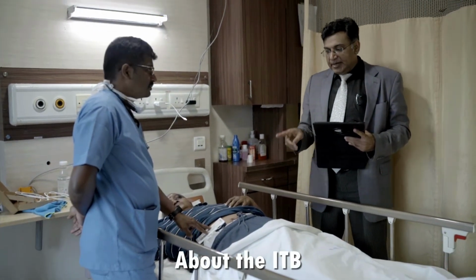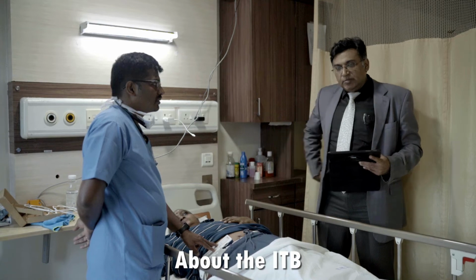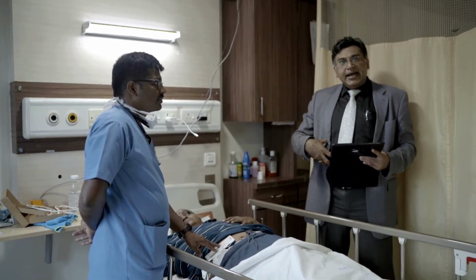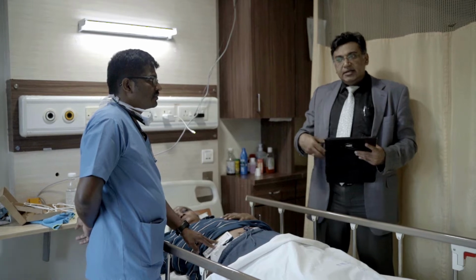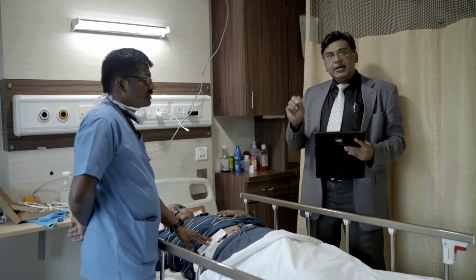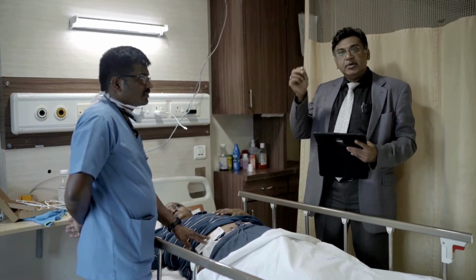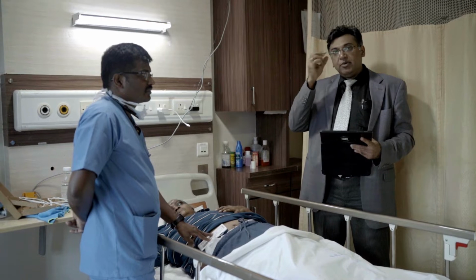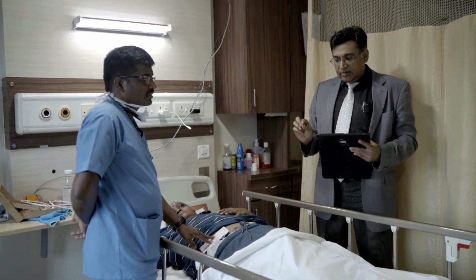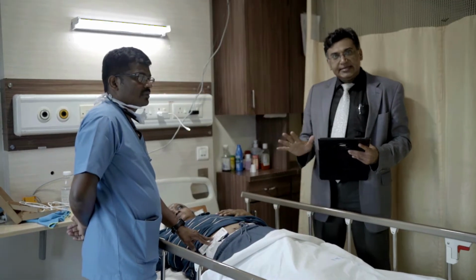I've implanted an intrathecal baclofen pump for her in the anterior abdominal wall with a tube that is going into her back. This pump has a tank capacity of 40 ml, inside which the drug is placed. At a pre-programmed rate, it delivers the drug through this spinal cord tube into a particular space on the spinal cord, where I have kept the tip. Now this can be programmed and adjusted as per the patient's requirements and needs.